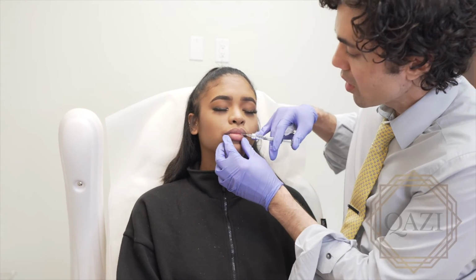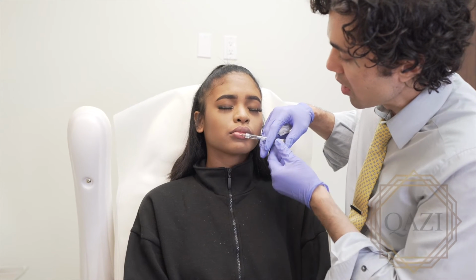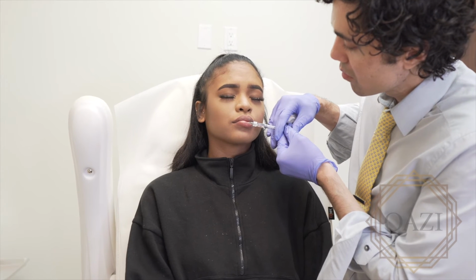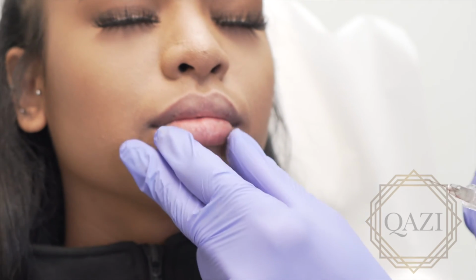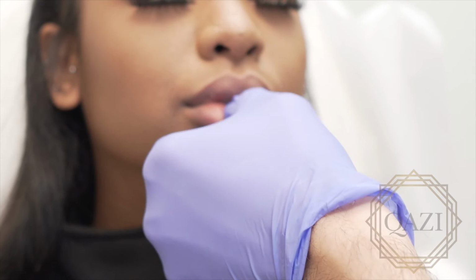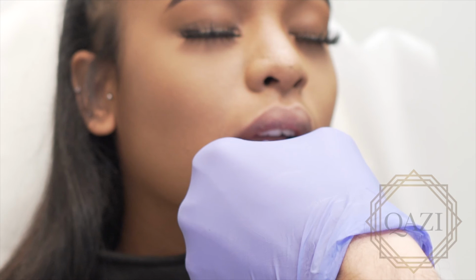Part of the real skill is actually making sure that you fill in any of the deficits that have occurred as you put in the filler. So you make sure you feel around, make sure that there's no areas where there's a lack of filler, and that's when you could actually run into trouble because those could be visible later on.